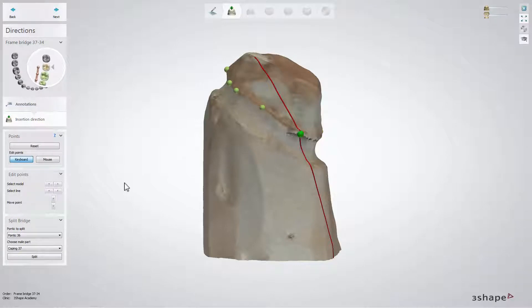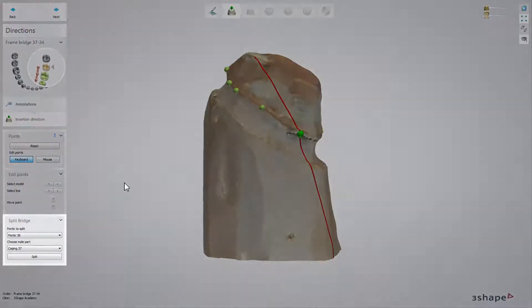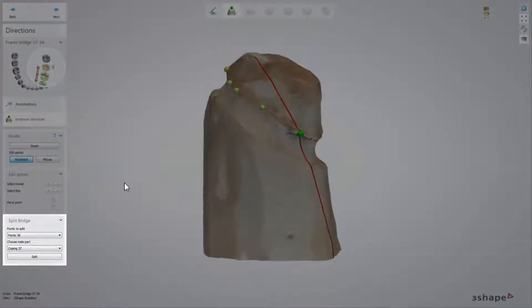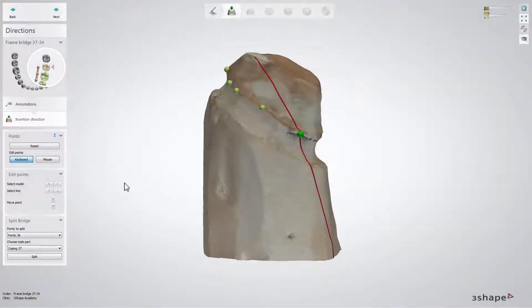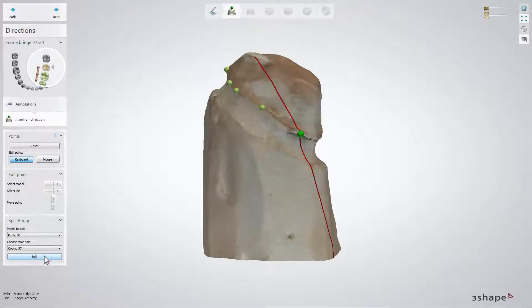Therefore, we are going to use the split bridge solution by choosing the indications where the split should be done. Remember that it will always be between a copping and a pontic rather than between two pontics.